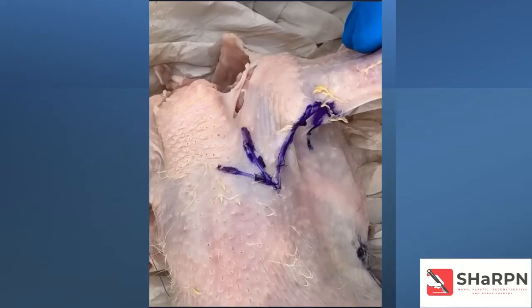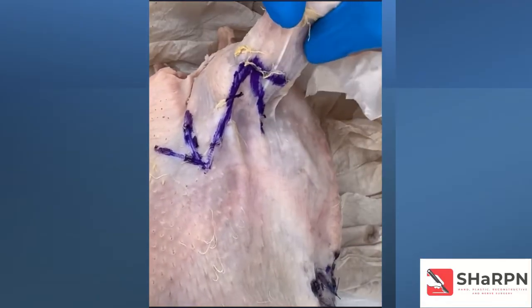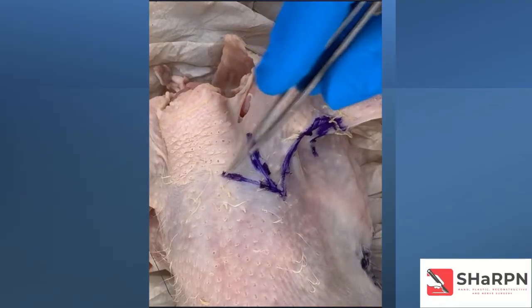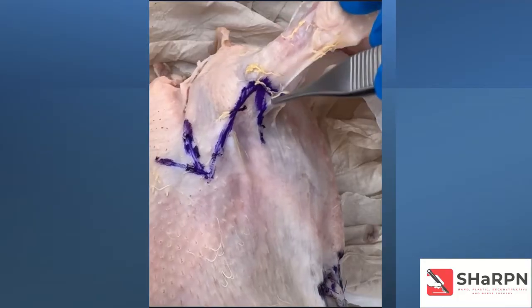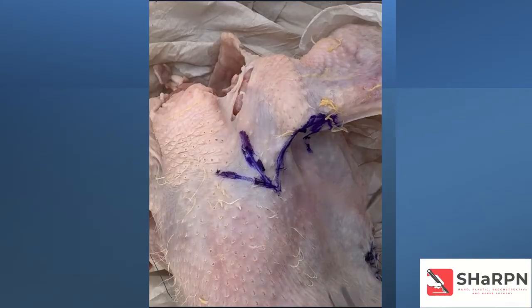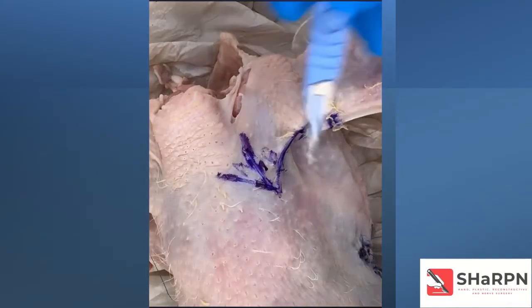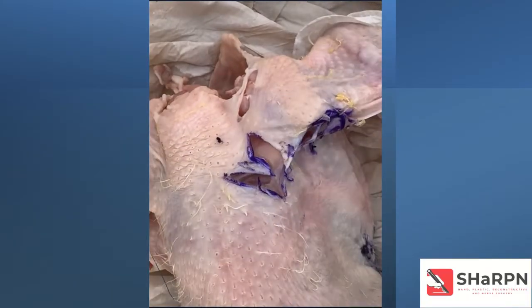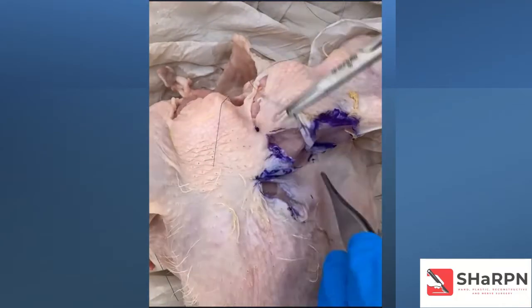So we will demonstrate this now on the other axilla of our friend the chicken, and I've marked out the 4-flap plasty here ready to go. You can see the first 90-degree flap and the second 90-degree and 45-degree flaps. As always, we cut out the scar after labeling A, B, C, and D and raise our flaps. And we release any deeper contracture that might be present.